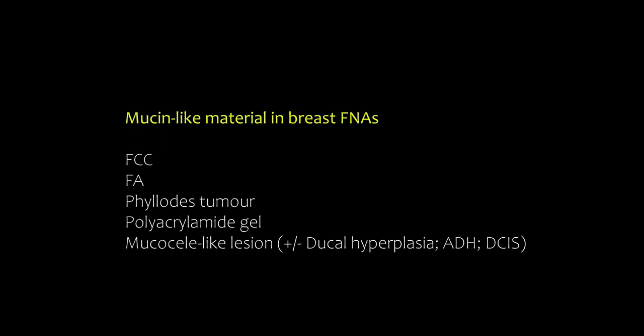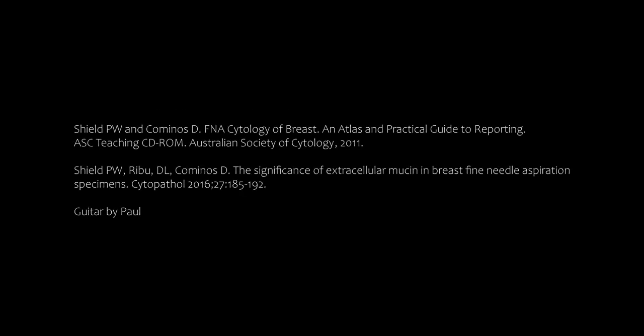You can also see benign mucocele-like lesions. These are often associated with DCIS and other lesions and form a spectrum through to mucinous carcinoma. So the presence of definite mucin in breast FNAs should be treated suspiciously and prompt further investigation.